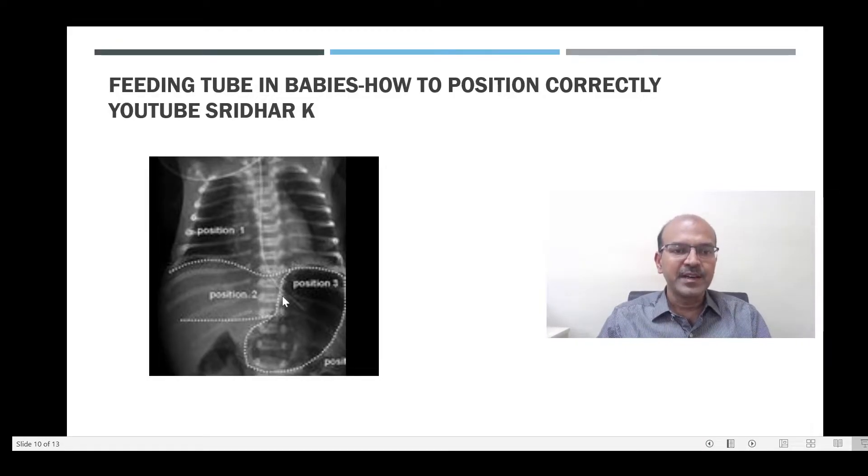This is the feeding tube and you can see that it is in the stomach in this baby. So a high feeding tube will stop anywhere from the gastroesophageal junction — it may be in the esophagus or higher. The second position is a little high but it is in the stomach, and we need to push it in a little bit.